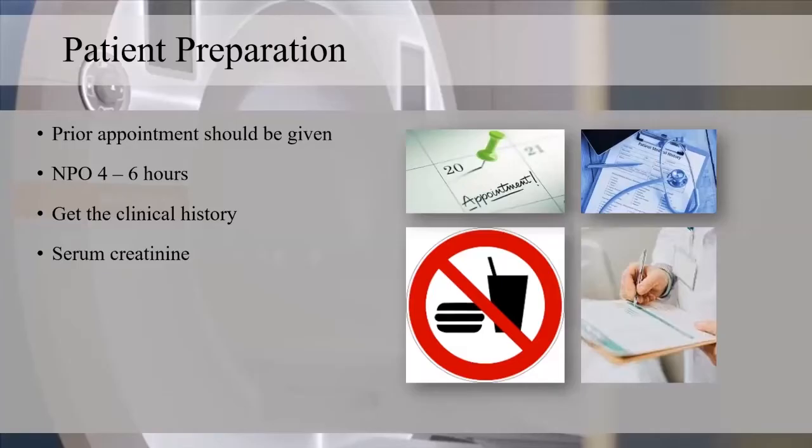Now, moving to the patient preparation. Here an appointment should be given. The need for this appointment is that the patient won't feel happy waiting in the radiology department. Even if they're waiting in the wards, the hospital room, or their home, they won't feel that much discomfort, but they'll feel a lot of discomfort when they're waiting in the department.